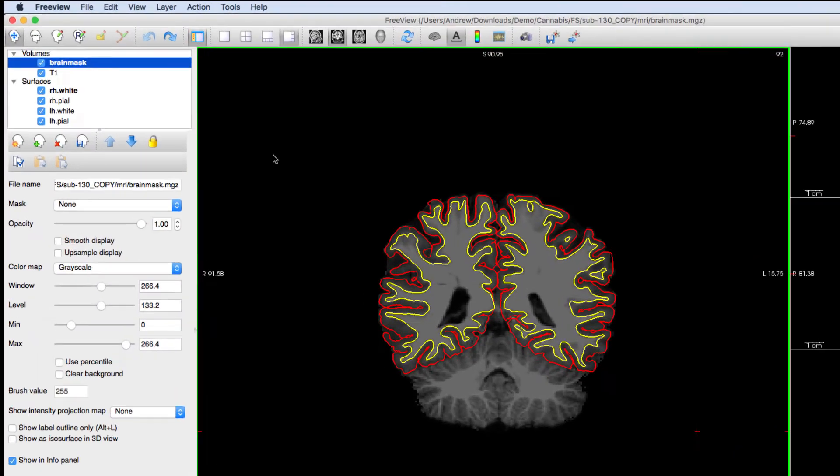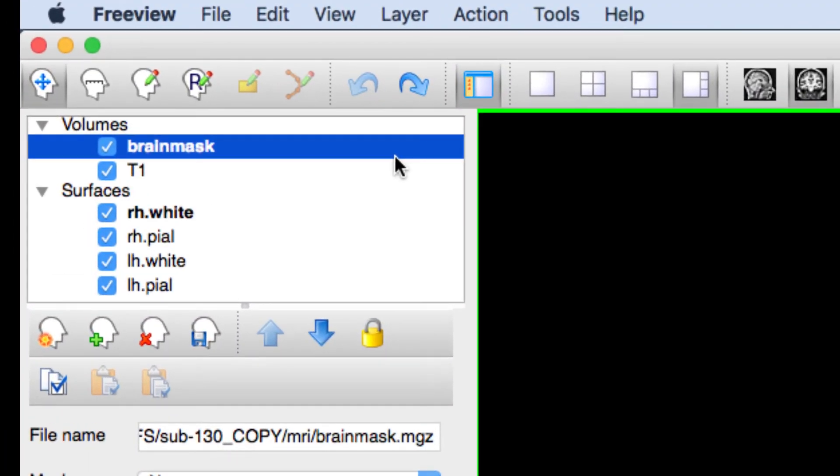First, make sure that brain mask is highlighted, so that our edits will only apply to that image. Then click this button, which enables voxel editing.